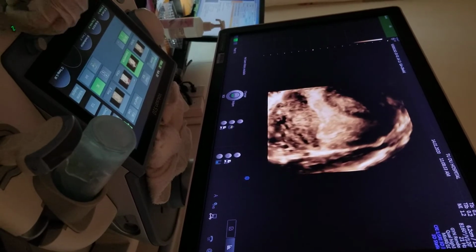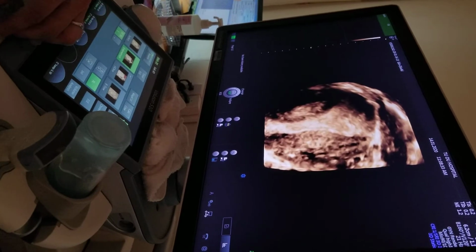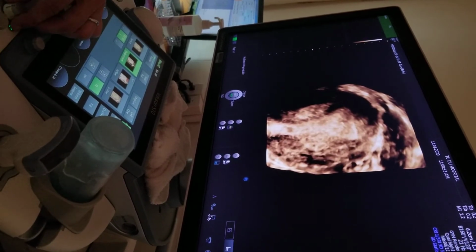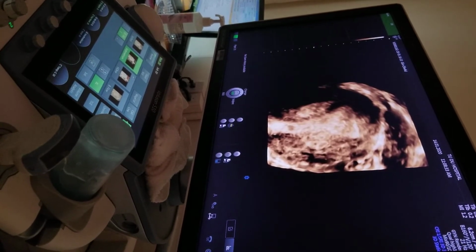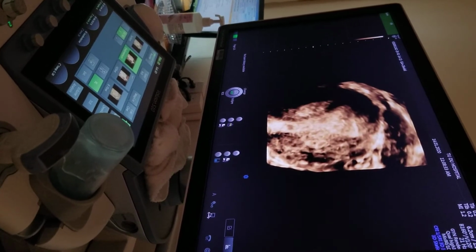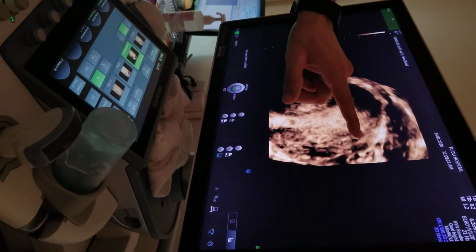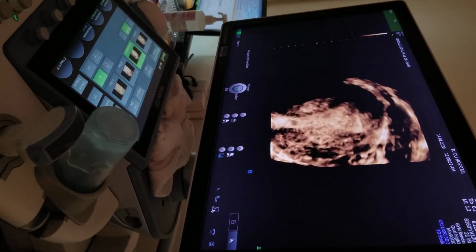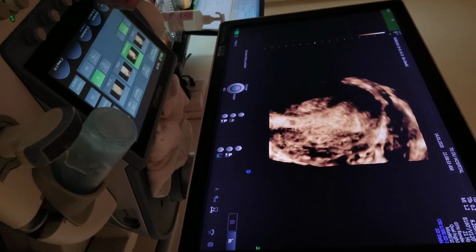And here you can change a little bit to see where is the best position. Okay, and here's the serosal surface and the endometrium. And you can change the contrast with the brightness. Where this zone, you see a little bit of adenomyosis here? It's thick here. You see adenomyosis here. And then this changes the threshold.